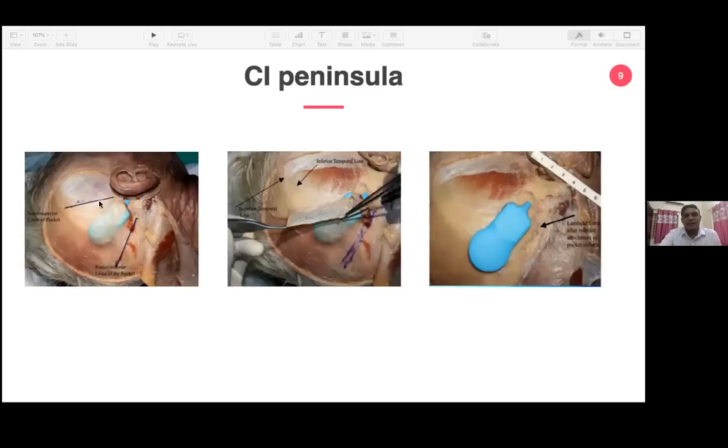So anteriorly it would be this suture line, the temporoparietal one, and posteriorly it would be a lambdoid suture, or more importantly you can call it the temporo-occipital suture line. So if you make a very tight pocket in the subperiosteal plane, this can go strictly here, in a tight pocket because of the tight attachment of this layer at the suture lines.